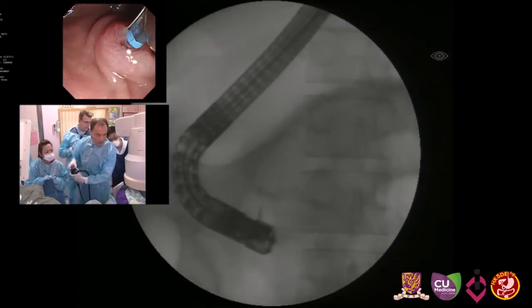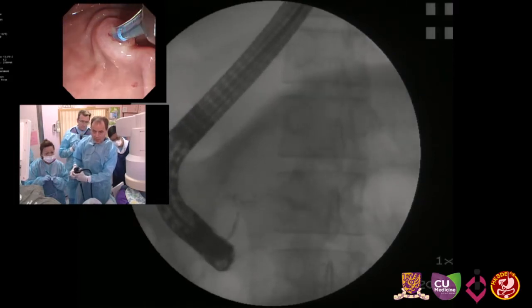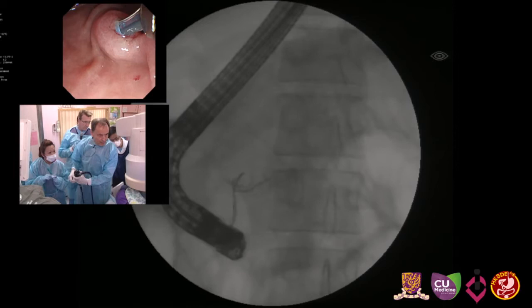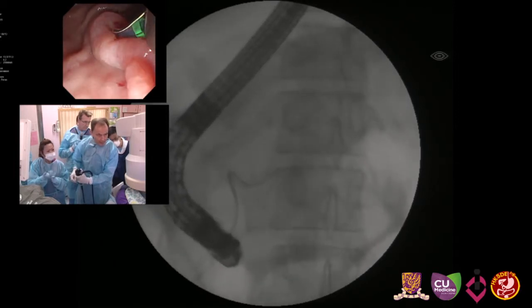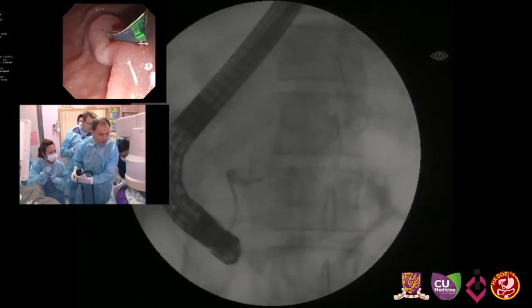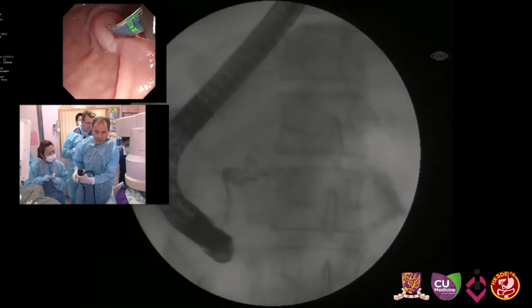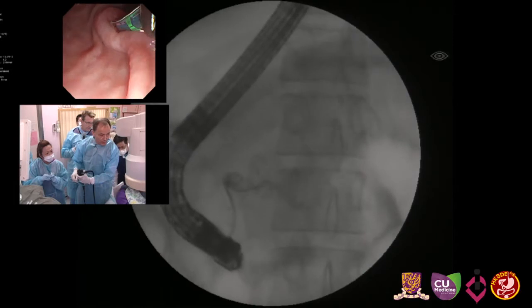So we can try to pass the stone on both sides. So I ask you now, I'm a little bit deeper inside. Yeah. There we go. So I follow, inject a little bit again to see. It's a stone cast, actually. Oh, it's a stone cast, yes. Okay, perfect. So push it, loop formation is always good in the pancreas.